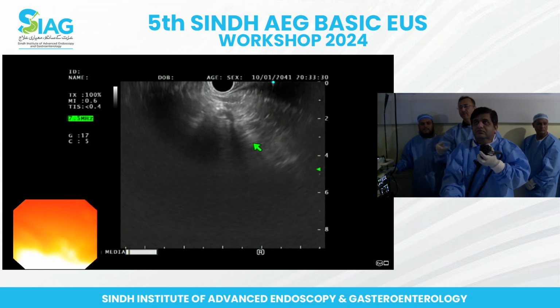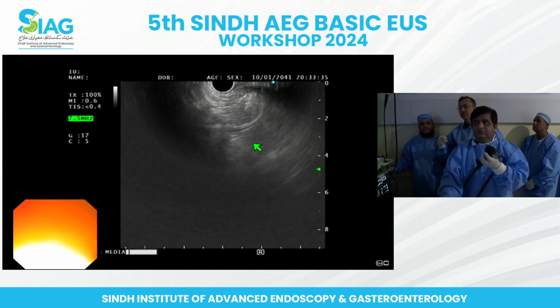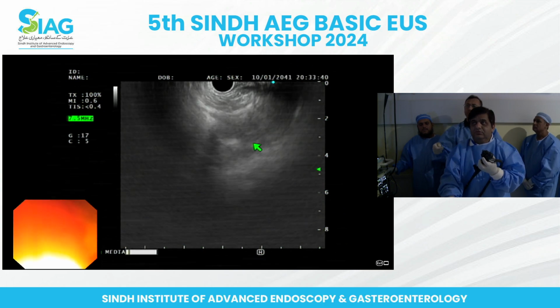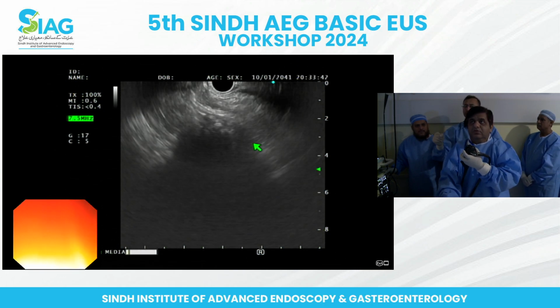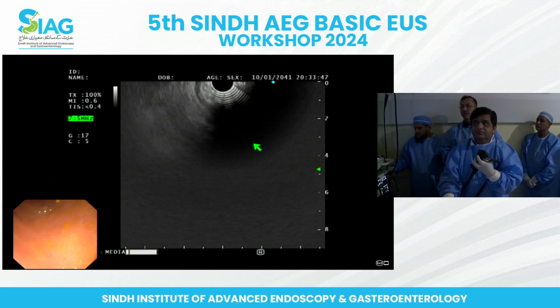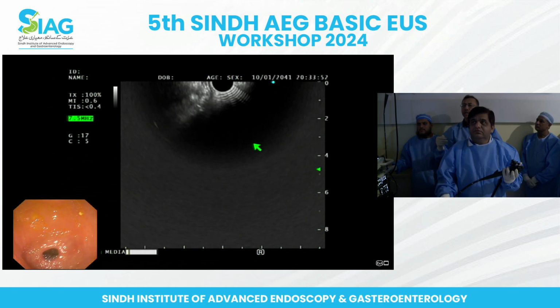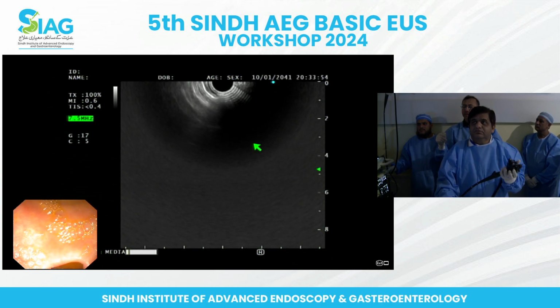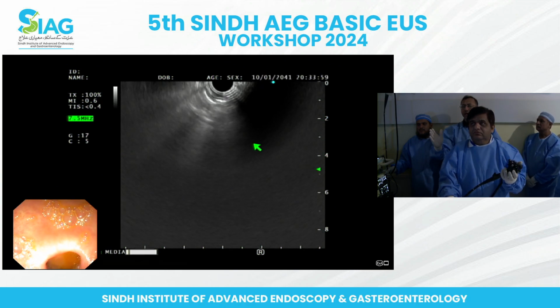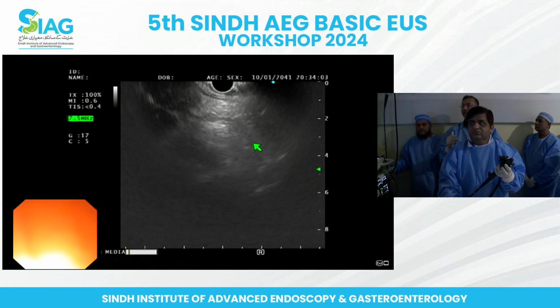Push, pull, that's going to bring the endoscope in line with the pylorus. So you're not supposed to push it straight. Push and pull back, push and pull back. That's the way you go into the pylorus with a stiff head without any difficulty. Now, where's the pyloric opening? That's the pyloric opening. So push and pull, push and pull. Even if you have seen the pyloric opening, usually the tendency is to go straight, but push and pull. This is going to keep you straight, and an easy intubation of the pylorus is made. Okay, very good. Go straight.